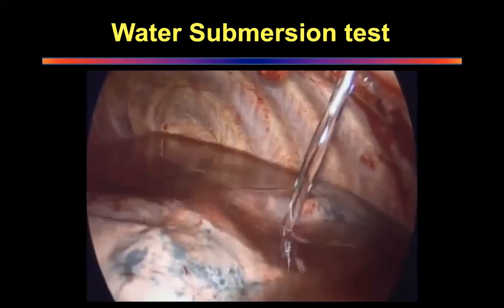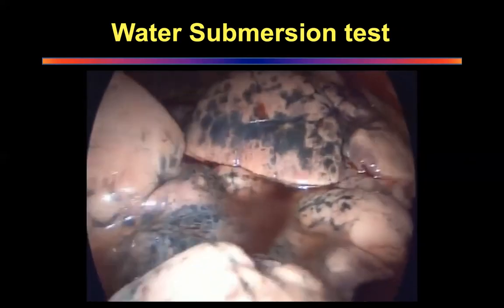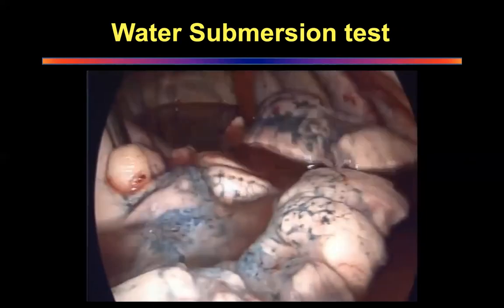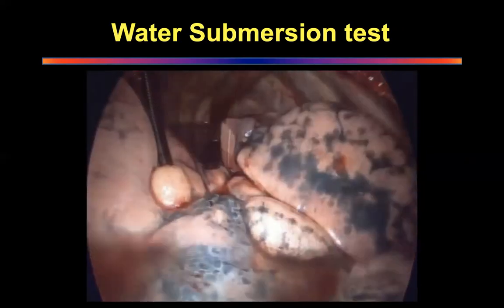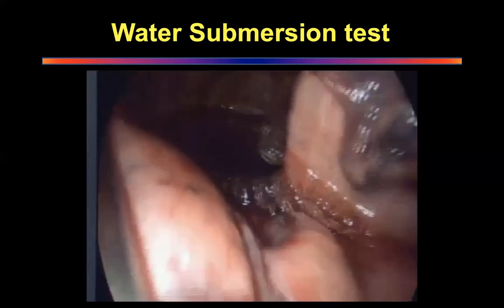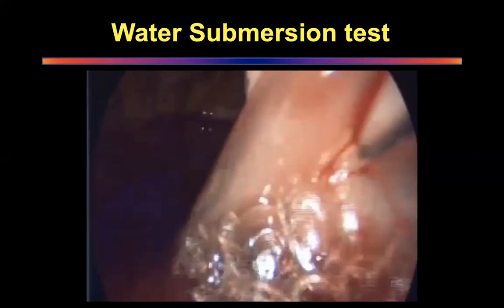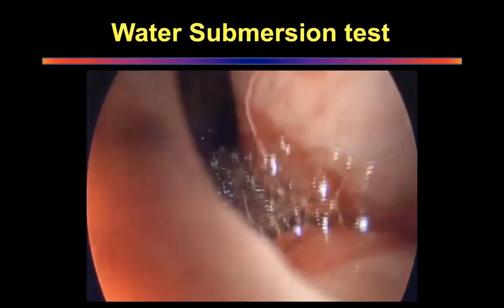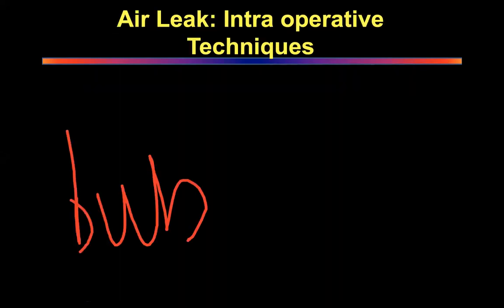So there I am pouring saline into my chest. I'm asking the anesthetist to re-inflate, and I will never close the chest till I've done this. And I will get the camera up close on my bronchial stump, and I want to make sure that there is no air leak. See there, this bubble would have been missed if there was no water in the chest. So it's very important that in every single case that you do, you must look for the air leak. And then when you see the air leak, you decide whether you want to treat it on table by suturing it or whether you want to be conservative with it.